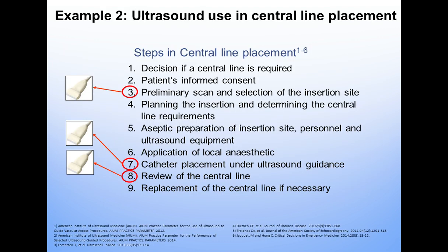So if we look at the steps involved in central line placement, we can see that the patient is scanned a number of times. They're scanned at the beginning to select an insertion site. That would typically be considered a non-critical procedure because it contacts only intact skin, and that probe should be low-level disinfected before that scan.